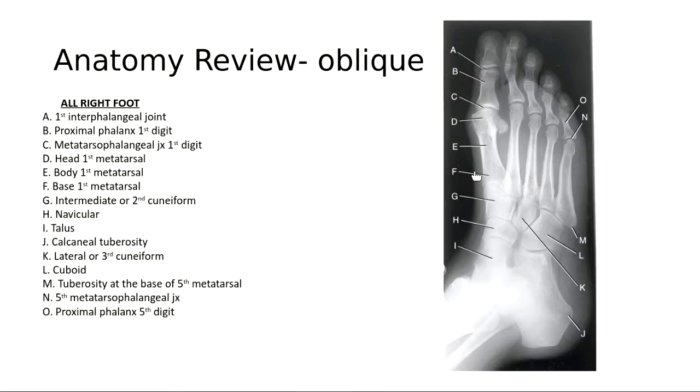So all of these should have right in there, but instead of typing that all out, I just wanted you to recognize it's all the right foot, because this is the first digit or the great toe, and this is the pinky. And in order for the foot to be like this for the oblique position, it has to be a right foot.